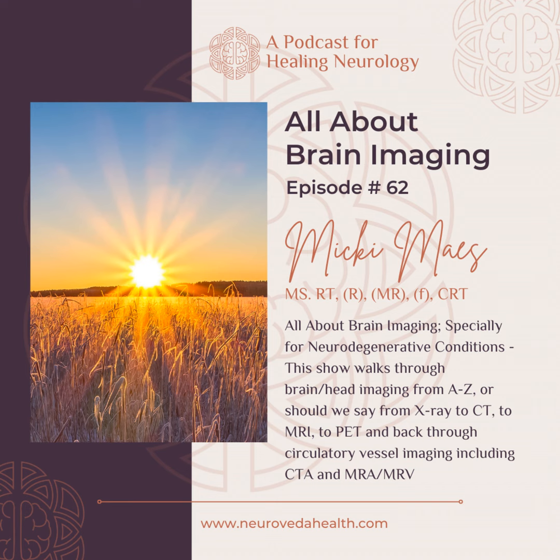And this is one of the differences between CT and MRI. CT is only acquired in an axial plane. So if it's reformatted into another plane, you're going to get some blurring and some degradation of the images. With MR, because you can acquire it in any plane, because it doesn't use X-ray the way CT does, you can acquire it in the plane that's going to best depict and image that specific body part that you're looking at.